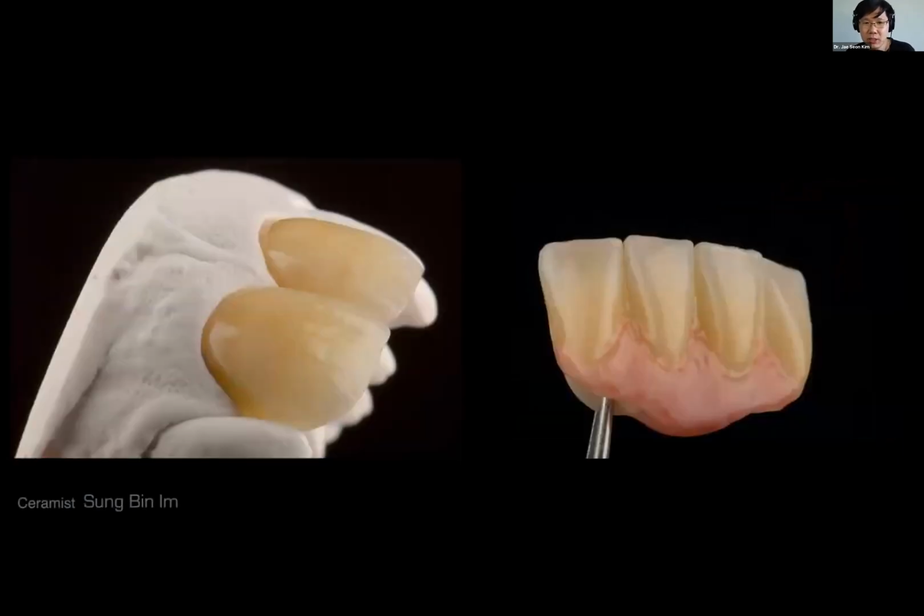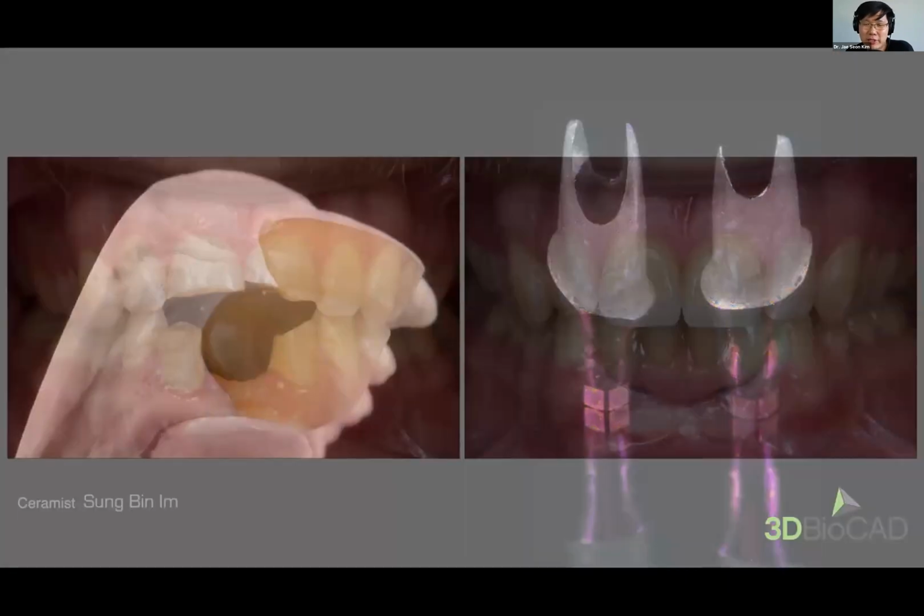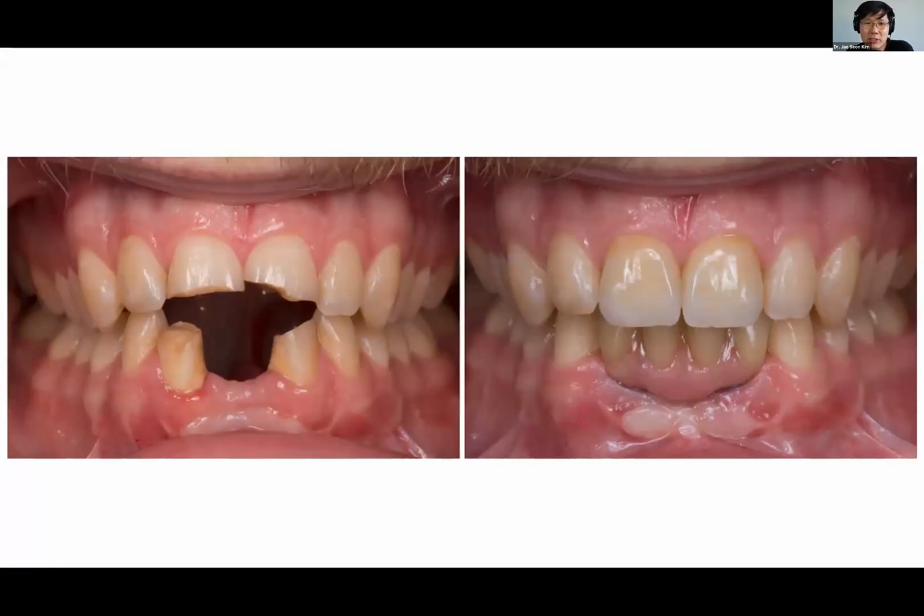So on the bottom, we used Katana zirconia with pink porcelain, and the uppers are Amber Press, and we anodized these implant abutments. I tried to do pink, but they actually don't have pink, and this is the closest to pink. I mean, it kind of looks like pink if you look at it in a certain way. But it blends in relatively well, and this is how the case turned out. We were able to avoid multiple surgeries, and the patient's pretty happy with the restoration.